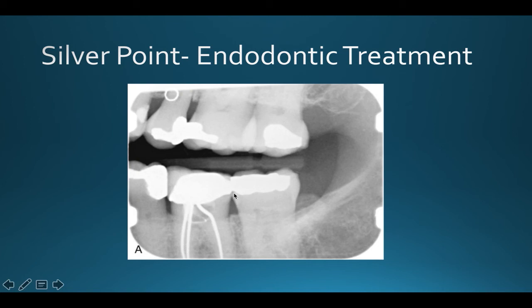So now let's look at this tooth. Let's look at the crown here. We had to determine what kind of crown this is. If we went through our list, we know it's not gold because it's got this hazy outline to it. So even though it's very radiopaque in the middle, we have a hazy border on the outside. It's too radiopaque to be silver, and it's definitely too radiopaque to be porcelain. However, this hazy area is light enough to be porcelain. Thus, we know this is a PFM, or a porcelain fused metal crown. We have porcelain on the outside, and metal on the inside. So, porcelain fused to metal crown.